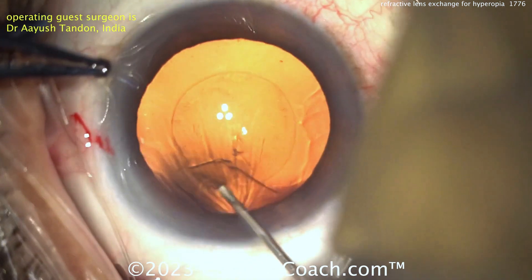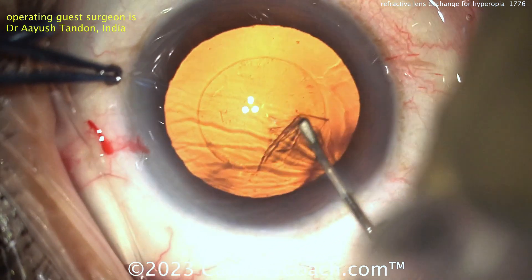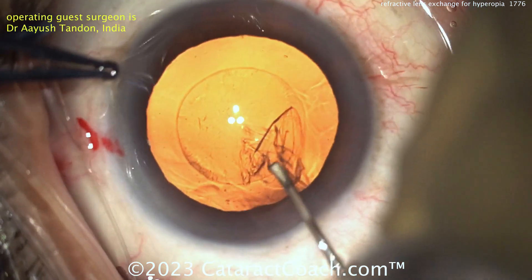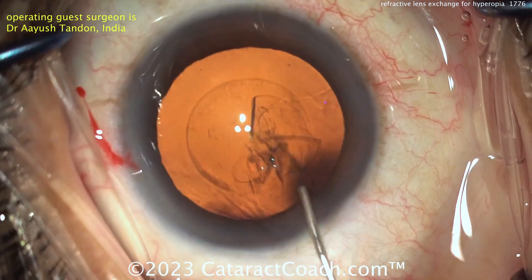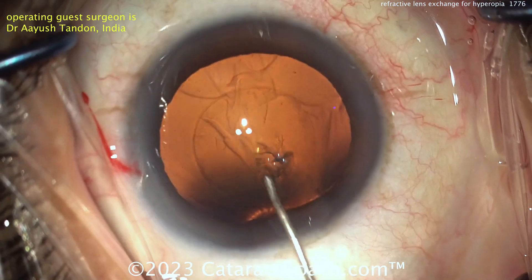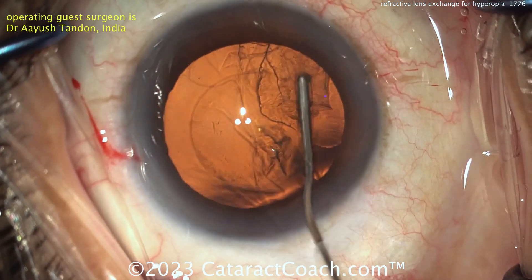With that multifocal lens in the eye, you really want to hit that plano target. For a lens like this you want to be as close as you can to plano — you don't want the patient to end up a little bit myopic. Don't overestimate the lens power; you want to be accurate. Now the BSS cannula for hydrodissection.